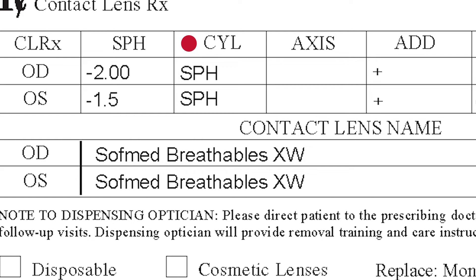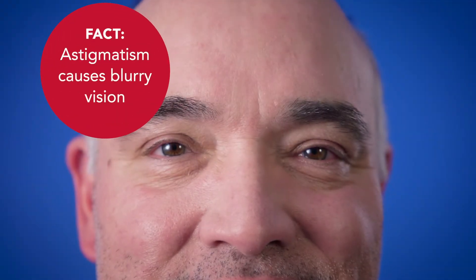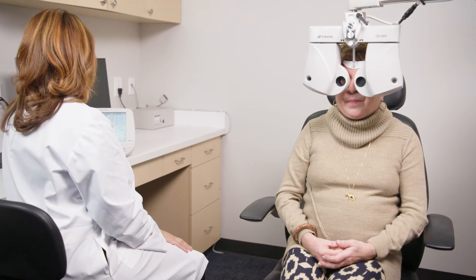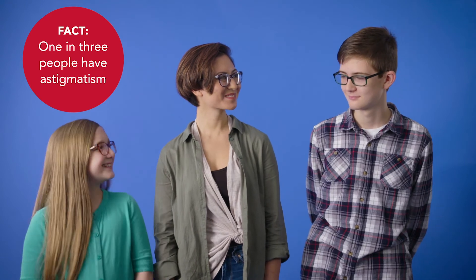Cylinder, or CYL, tells if you have astigmatism, which means things may look blurry because your eye isn't totally round. If you don't see a number here, you don't have astigmatism correction in your contact lenses. But if you do, the number represents how much lens power is needed to correct it. And there's no stigma to astigmatism — one in three people have it.